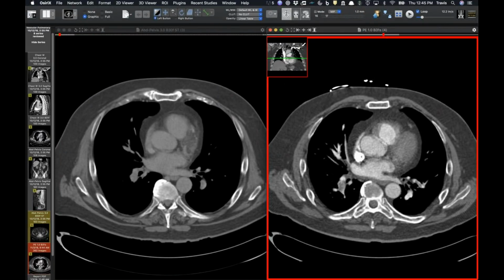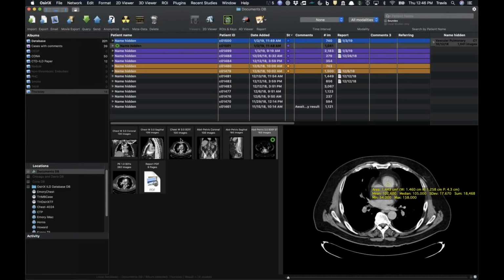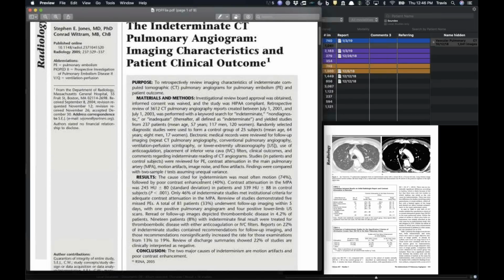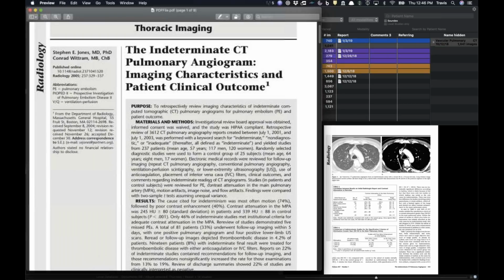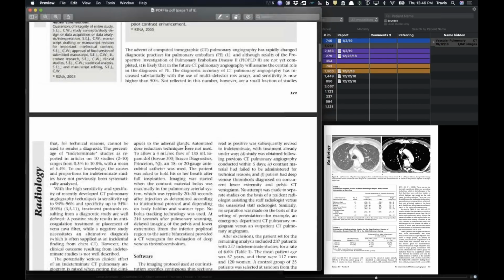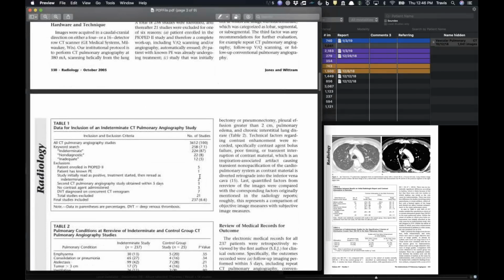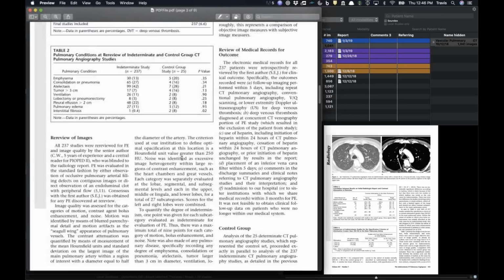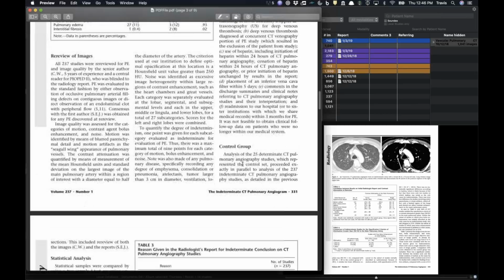But the discussion we were having maybe a month or a month and a half ago about where this whole number of 150 Hounsfield, or 200, 250 Hounsfield unit thresholds came from. My colleague Kim was able to find this one paper, from the Mass General group from 2005, and this is really the only thing that we could find. They just say somewhere in their techniques that at their institution they use 250 Hounsfield units as a threshold.